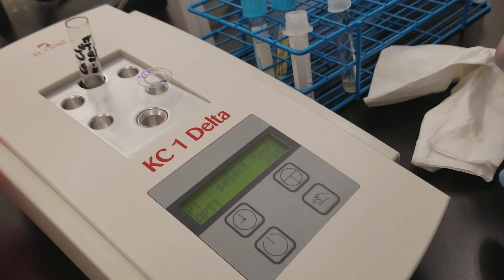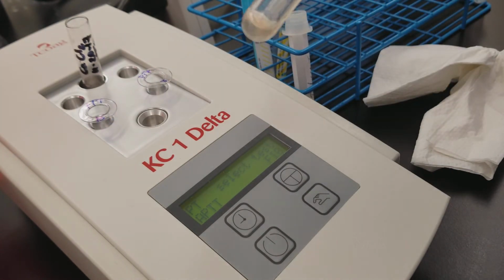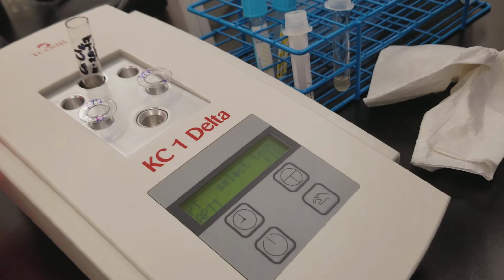Okay, so we're just going to do PTT, so you'll get the feel of how all this works. Okay, so with PTT, we have two specimens here, 15 and 8. 15 does not look like it's clotted. To clear, actually, I think that's. This could be just because it's been frozen for a long time. These are actually pretty old, so that is obviously going to affect what we're doing here. But I want you to see the difference between the two. So we'll see how 15 goes.